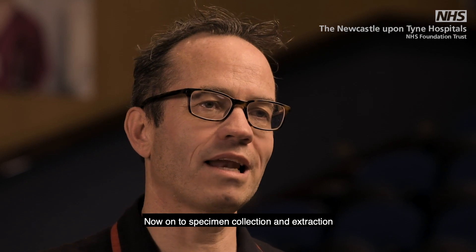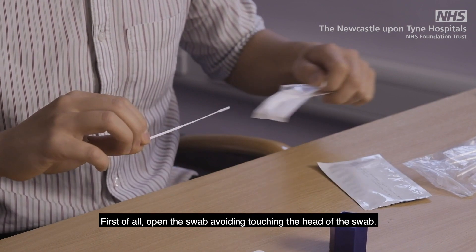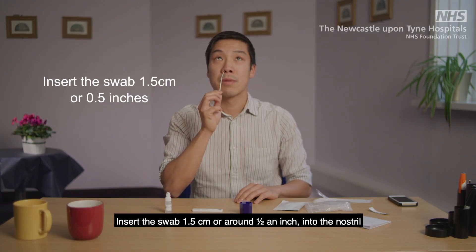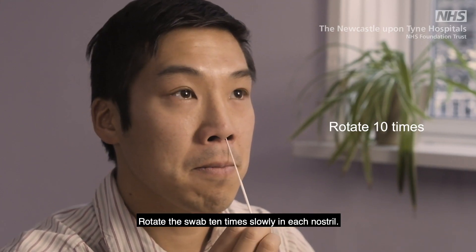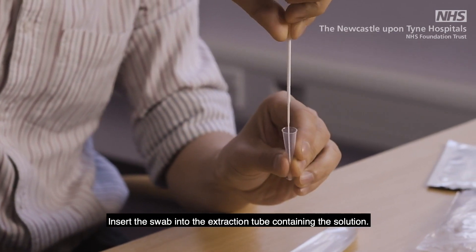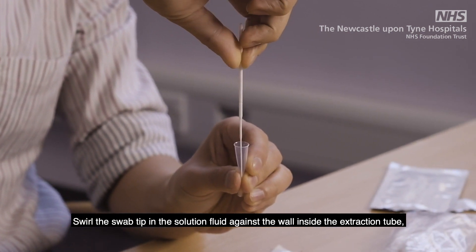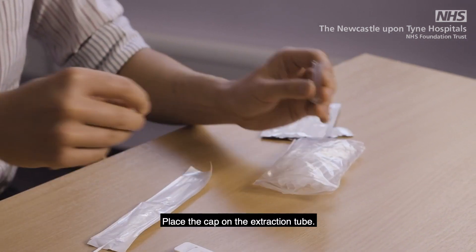Now onto specimen collection and extraction. Open the swab, avoiding touching the head of the swab. Tilt your head back. Insert the swab 1.5 cm or around half an inch into the nostril. You may feel a slight resistance. Rotate the swab 10 times slowly in each nostril. Insert the swab into the extraction tube containing the solution. Swirl the swab tip in the solution fluid against the wall inside the extraction tube, squeezing the tube from the outside.